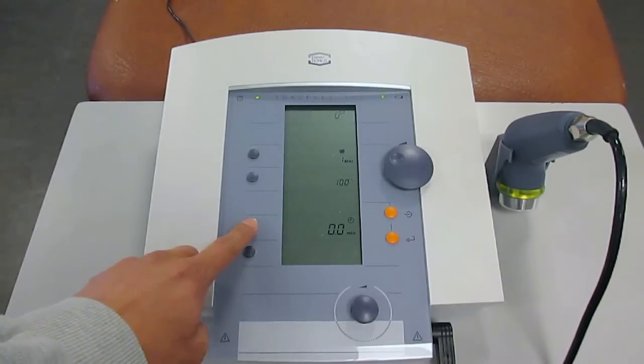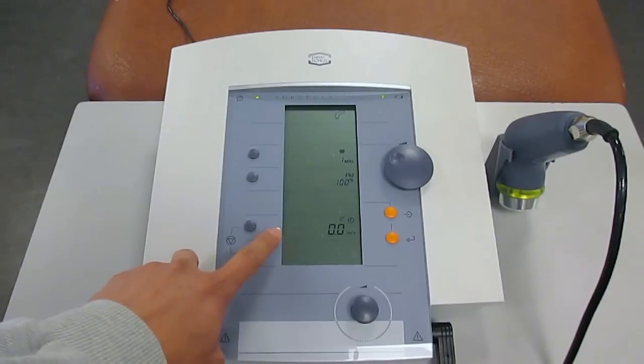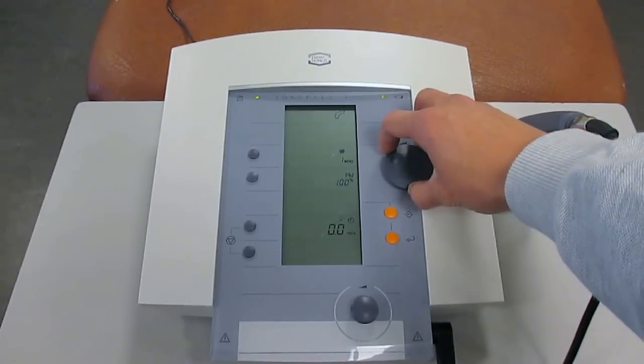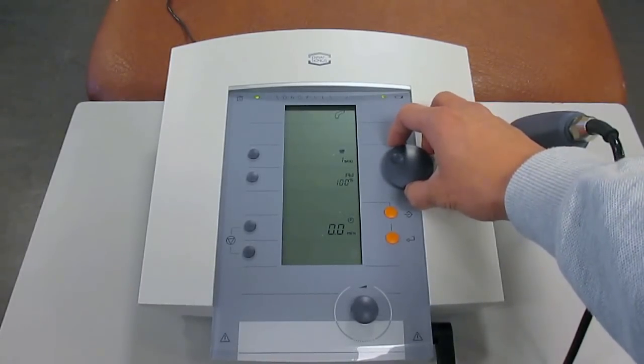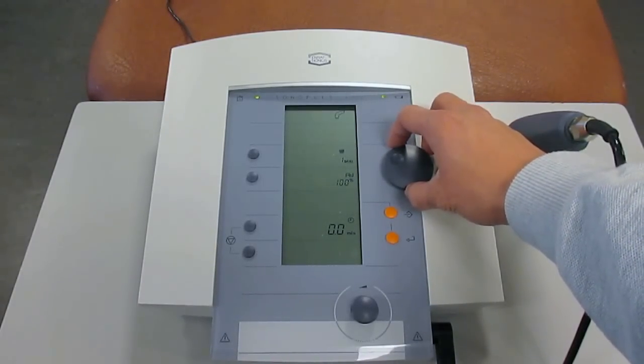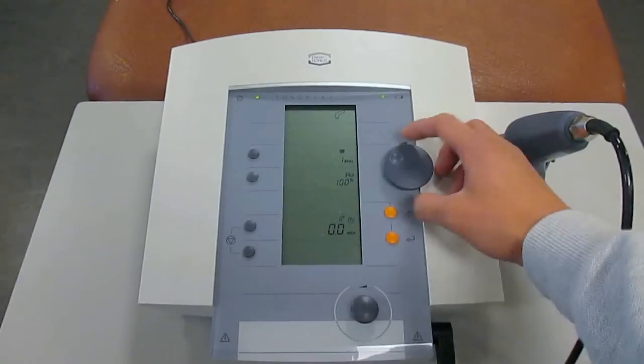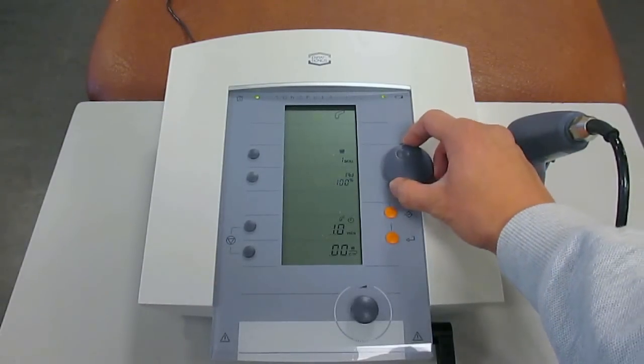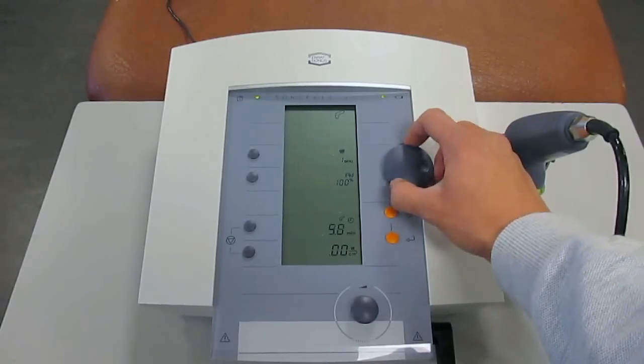This setting over here controls the amount of minutes that you'll be setting for the therapeutic treatment time. The therapeutic treatment time depends on the depth of the tissue and the area that you're trying to treat. You can simply press on that grey button over here and use the dial to increase the amount of time.